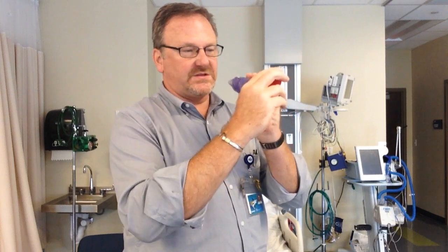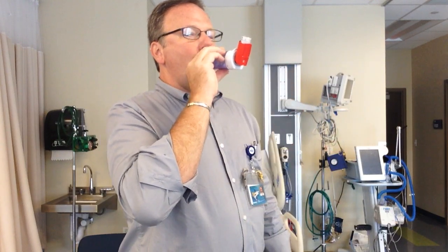When you set this up for the patient, you want to shake up the albuterol — or whichever medication — to make sure it's nice and mixed. The patient exhales fully, puts the spacer in their mouth, then squeezes and inhales at exactly the same time. After that, I counted off 10 — you want the patient to try to hold for a count of 10, about 10 seconds. This allows the medication time to rain out or settle into the lungs so that it does the most good.